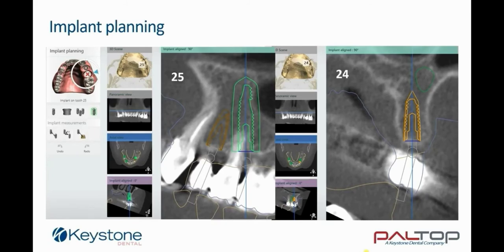The apical portion of the implant threads engage the cortical bone of the sinus mesial wall. Implant 24 is planned in the narrow corridor between the root anatomy of tooth 23 and the distal implant. Whilst the safety zone of implant 24 is reduced, to achieve this, careful attention is given to ensure the apex of implant 24 does not collide with the adjacent implant 25.